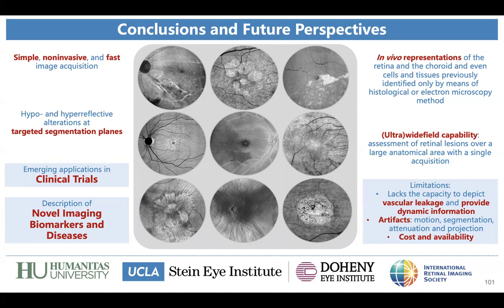As you were mentioning, and I totally agree with that, a multimodal imaging approach is now essential in every retina clinic. I think very practically, if we have a fundus photography, if we have an en face OCT and OCTA machine, which can actually show us en face OCT, en face OCTA, and cross-sectional corresponding scans. And if we also have the possibility to perform angiography, I think we are done.